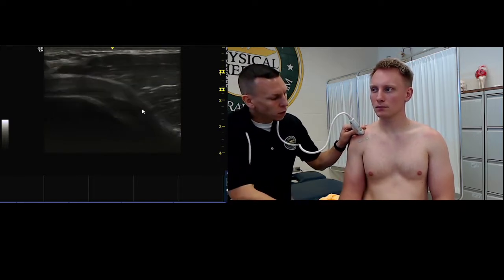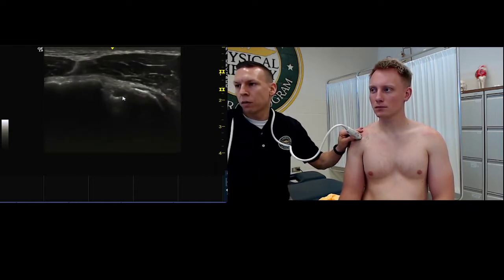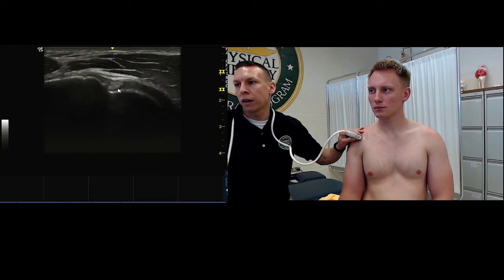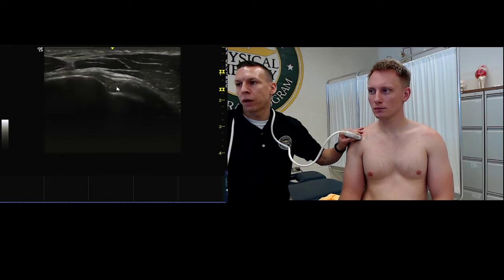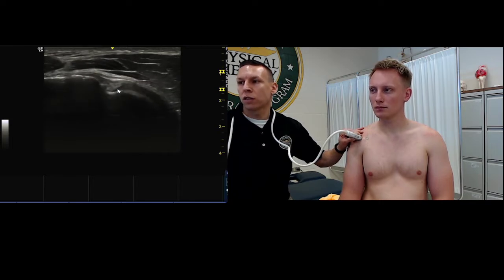All right. We're going to come back down to that home base between those two bony structures, and you want to take your biceps tendon here again, kind of toggle and make sure it appears and disappears. And when it disappears, you would say maybe anechoic, that's anisotropy, that's just an artifact, which we talked about before.